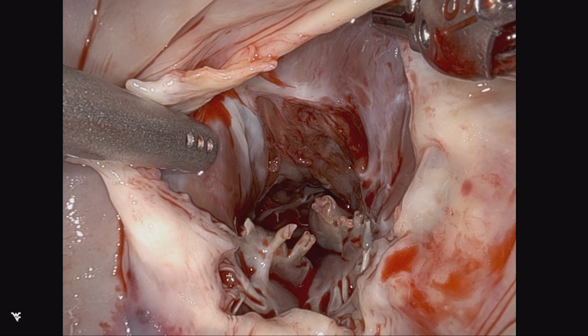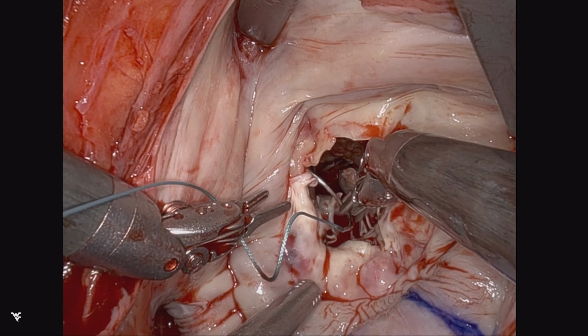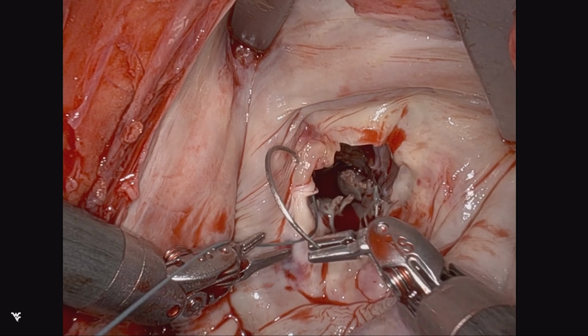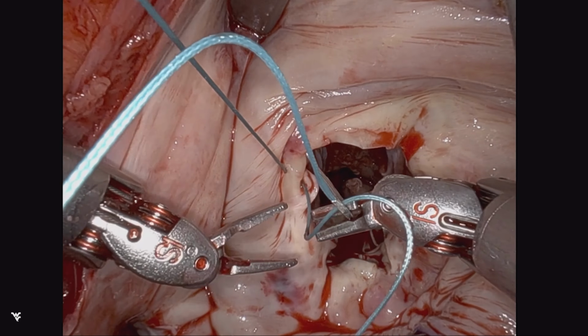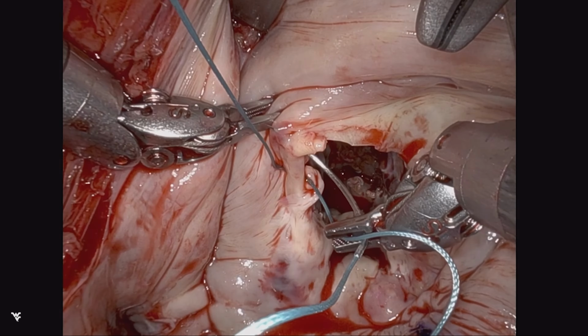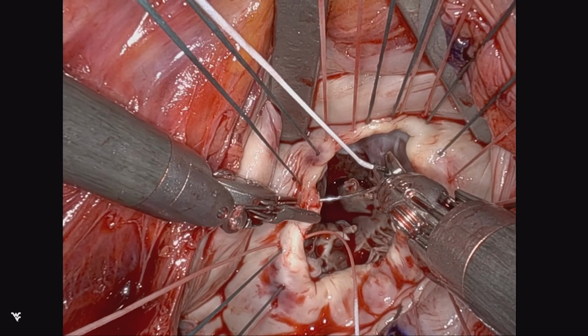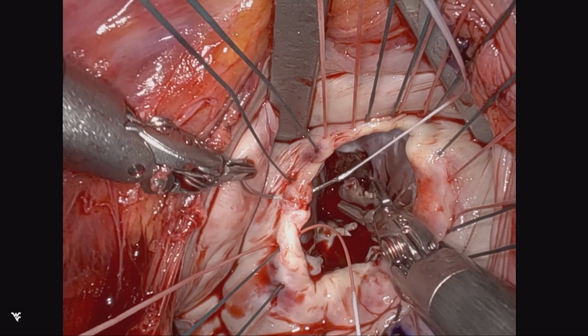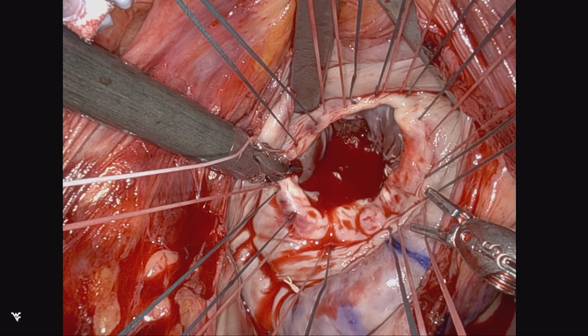And without resecting the MAC, we're going to put slightly larger needles to encircle and fold the anterior leaflet tissue, as it's nearly an autologous pledget equivalent. And then we'll be able to use these to get around the MAC, which was fairly straightforward in this case.